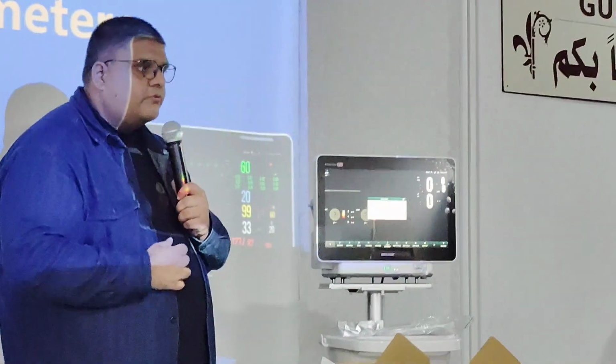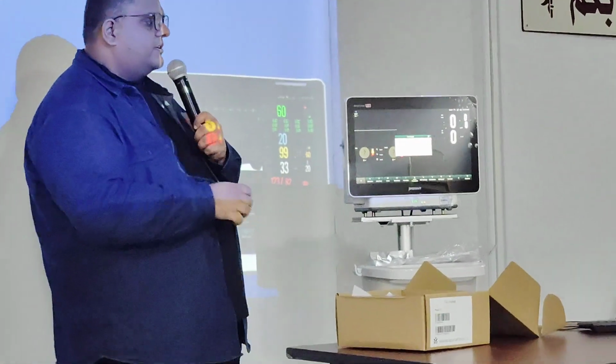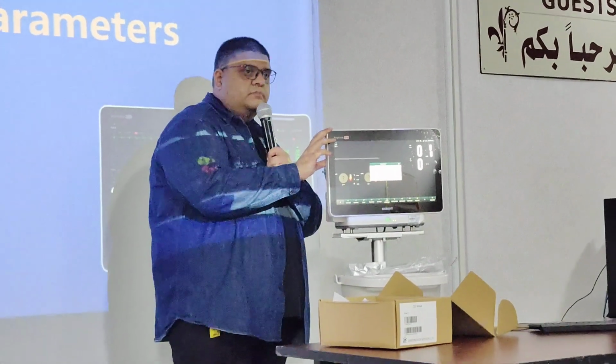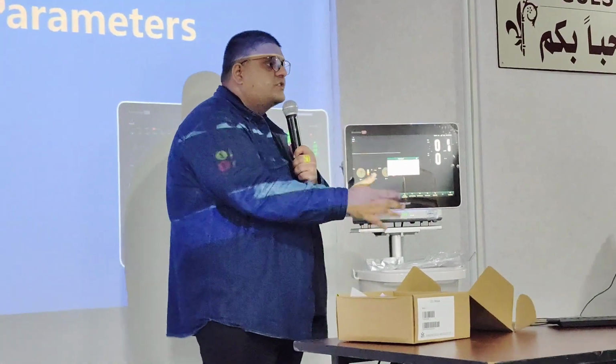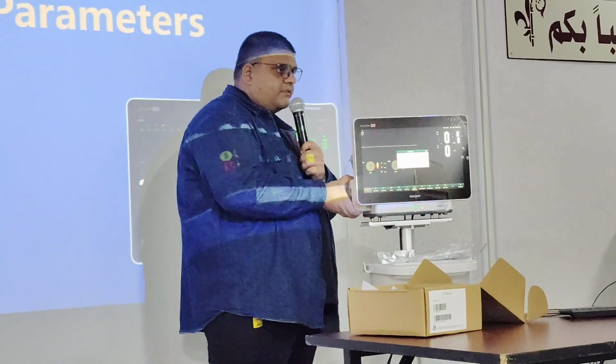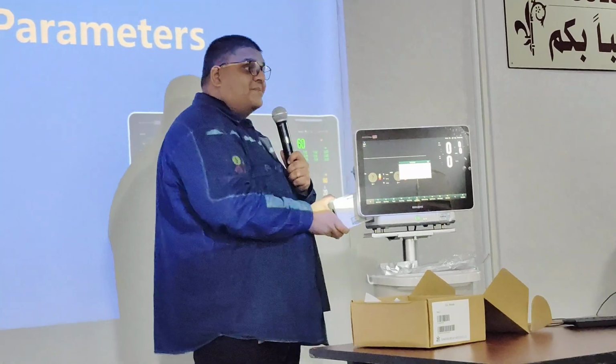What if you plugged it into the wrong monitor? What will happen? For example, this monitor was not being used on this patient before. So the data in there didn't discharge the patient from the monitor. So the data in there was from a previous patient. What if I take this from another patient and put it in another patient's monitor?